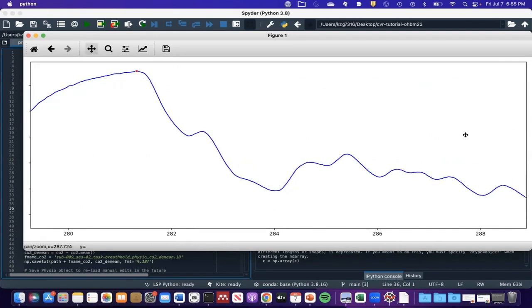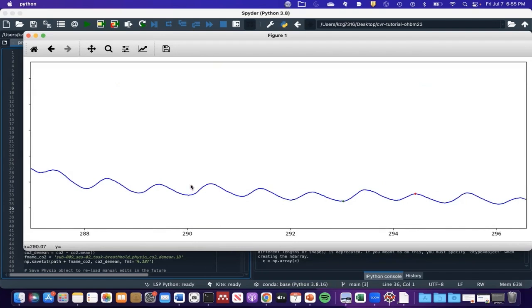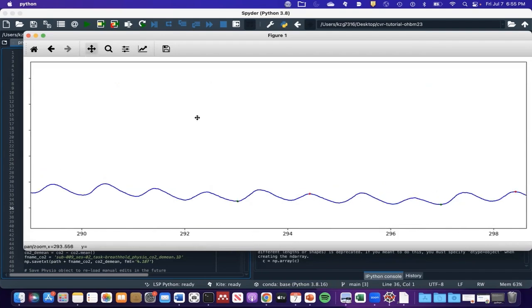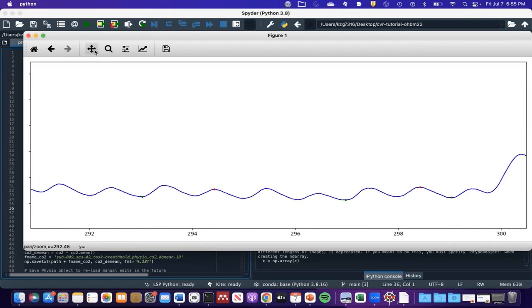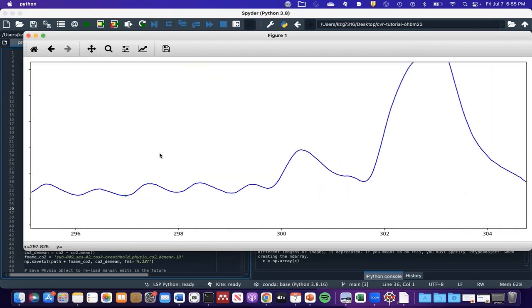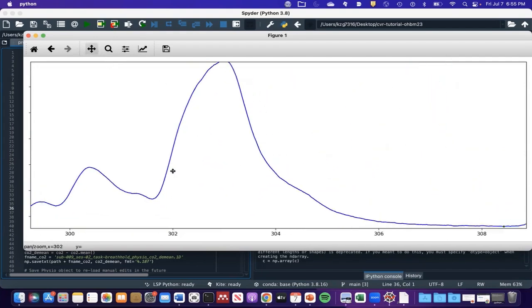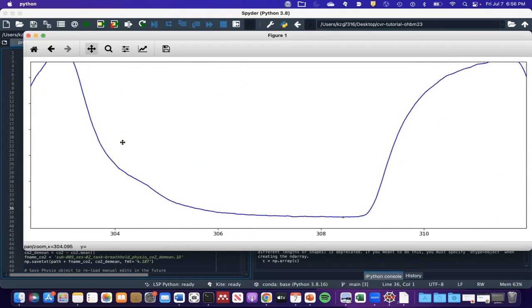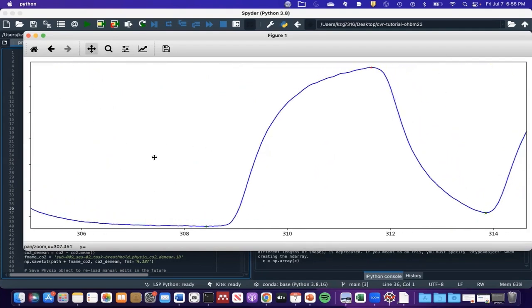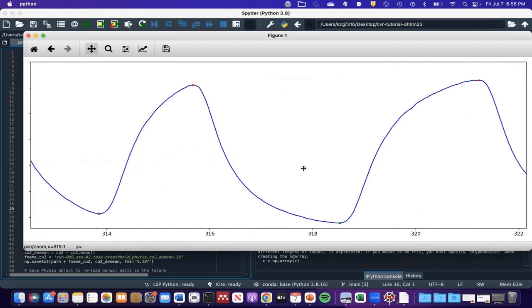That one I will keep, and then to the next hold those. Keep that peak after the breath hold. We should be getting close to the end of the scan here.